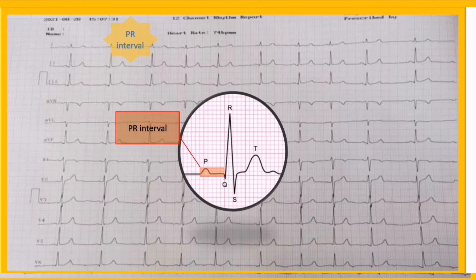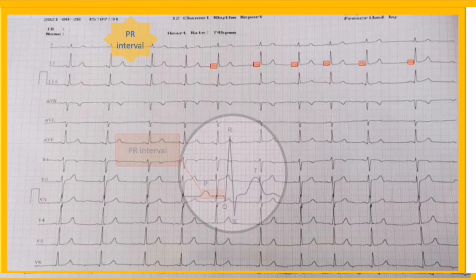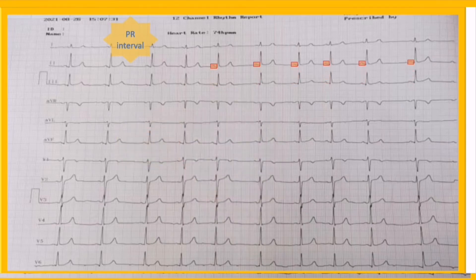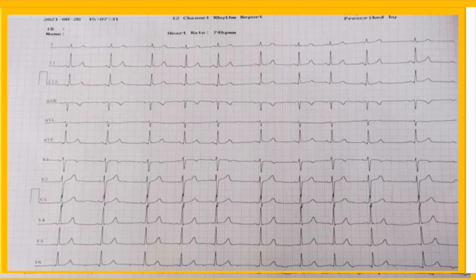The length of the PR interval varies with heart rate and is normally three to five small squares. Here, the value of the PR interval is stable and within normal ranges, which means that the AV node functions normally.